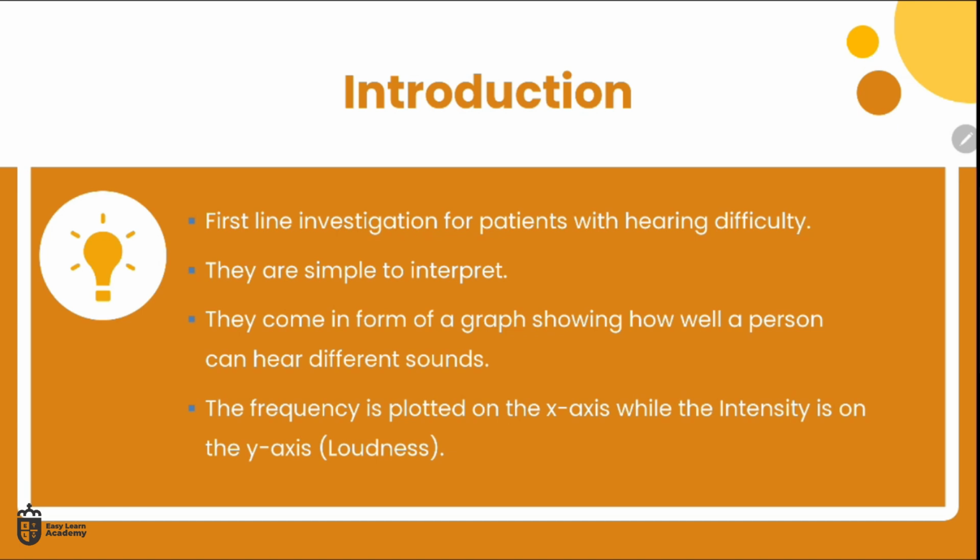It comes as a graphical format with an X and Y axis. I'll show you a picture of how an audiogram comes in the exam. I mean, beyond the exam, for the ST ones, it can come to you from the hospital as a letter or from a hearing service, such as Boots or Specsavers hearing service.